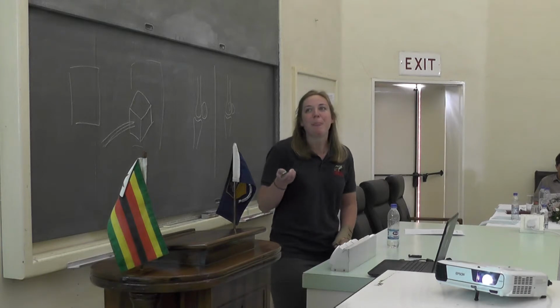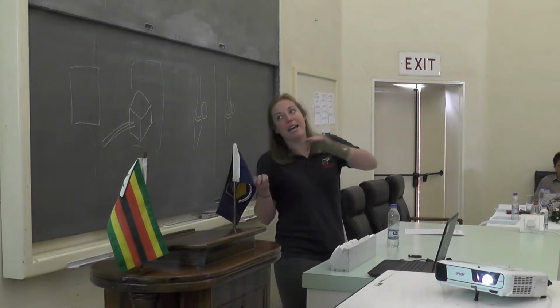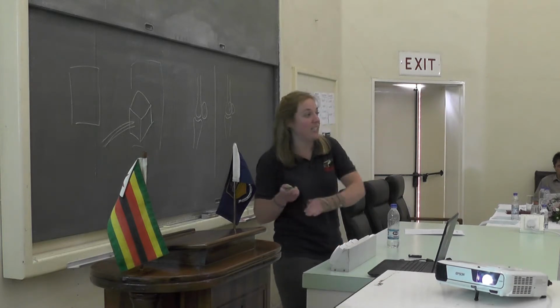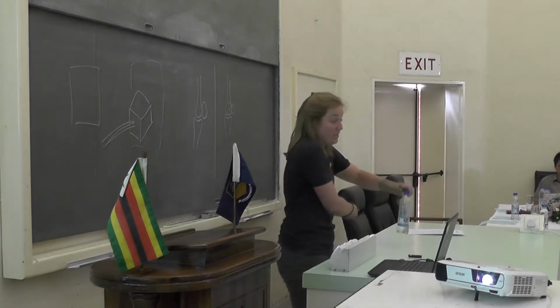And then we use this one very commonly as well. It actually has in reality a longer name than here, but I've just shortened it to dorsoproximal palmarodistal oblique. And again, it sounds like a mouthful, but if you think about what it says, you're shooting from proximally, so higher up on the dorsal aspect, and you're landing your beam palmar and distally. So it's sort of a diagonal one. You shoot from proximal and from dorsal, and you land palmarly and distal.